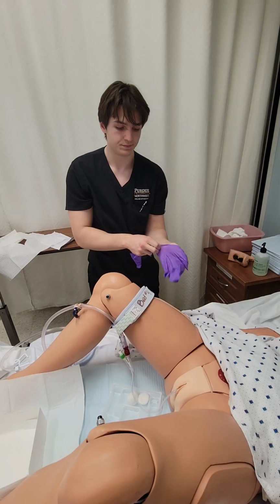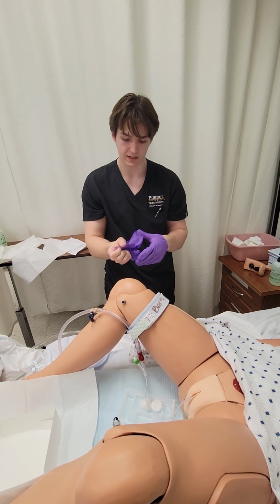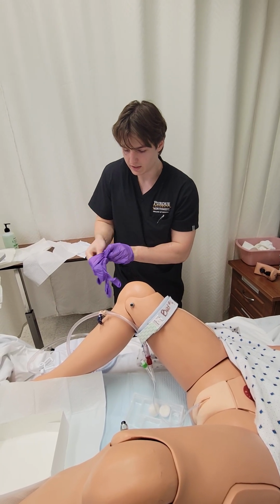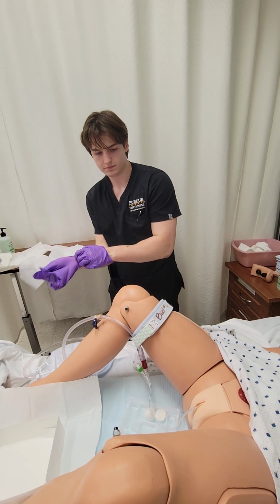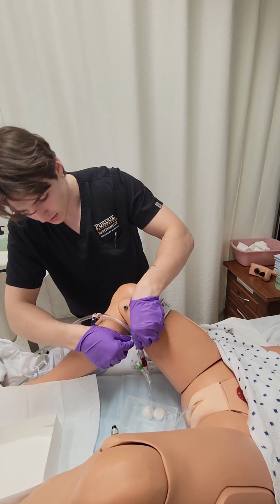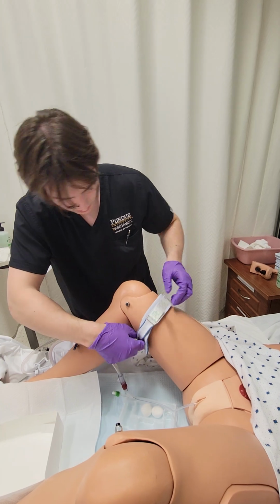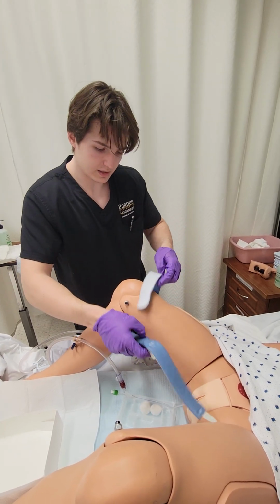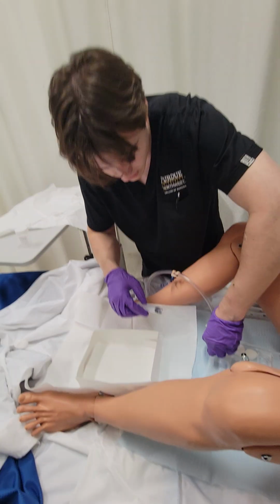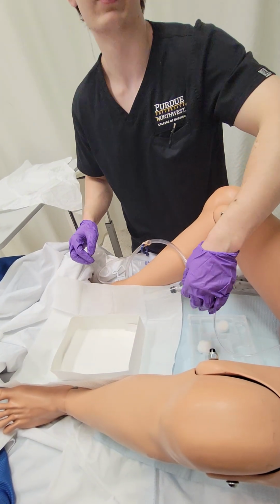Since there would be some time before the catheter would be removed, now would also be another good time to ask my patient if they're experiencing any pain or discomfort, or any other concerning things that I should know about. But it's a mannequin, so it cannot respond. So now I will undo this, let that fall for just a little while, untie this, set this to the side, grab my syringe, place it in here, and allow gravity to do its thing.